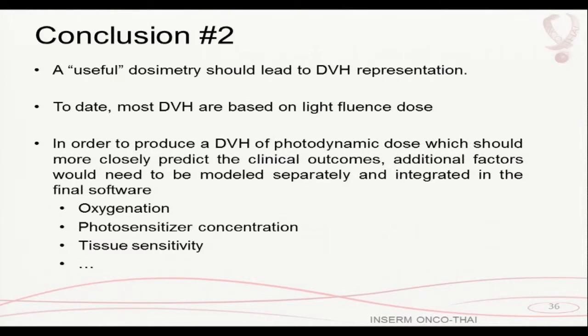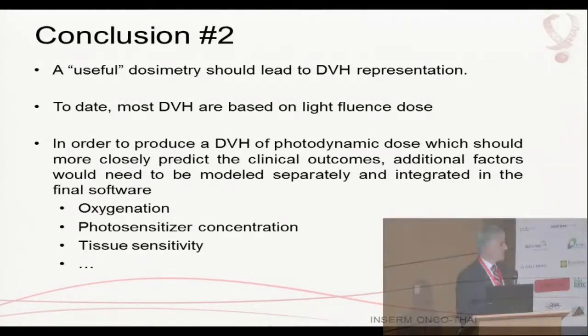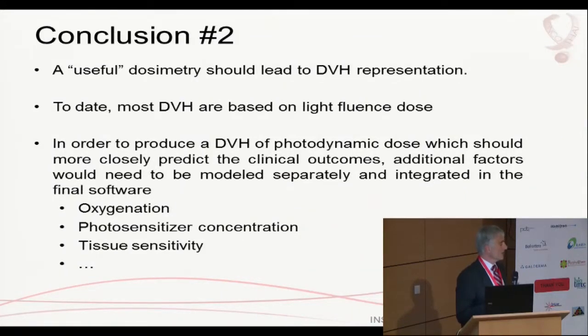So, in conclusion, I was fast, but I have important announcements. A useful dosimetry should lead to DVH representation. I think, as a PDT community, we should make progress all together. What we need is to promote this technique and convince other people that PDT could play a role. We are now competing with radiotherapy and chemotherapy, and we need to speak the same language sometimes.